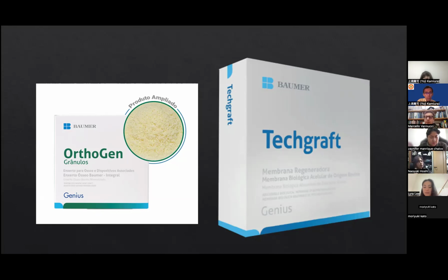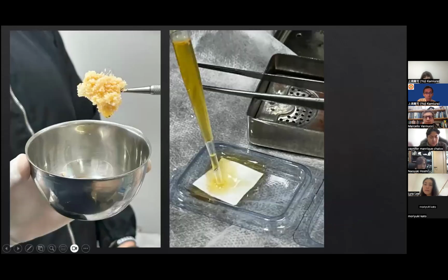When you put this biomaterial with IPRF, you get this one, the sticky bone. It's easy to work with the sticky bone. You can put it on the lesion and work with great ease. And the cellular content is all here. So you can put it on the membrane too.